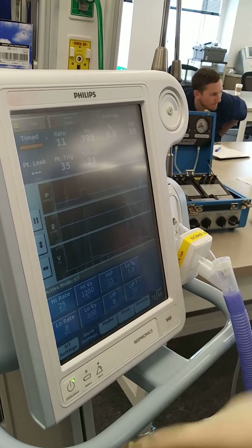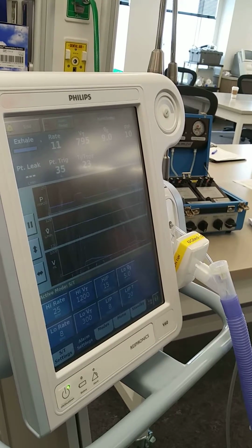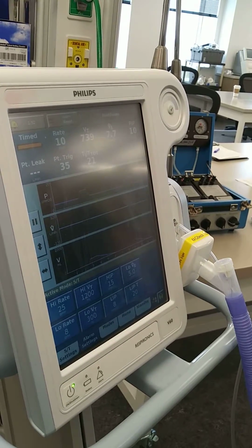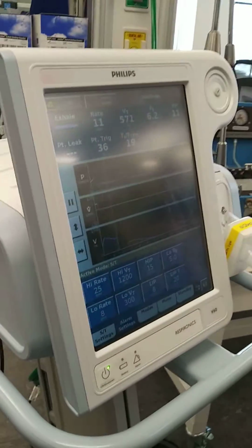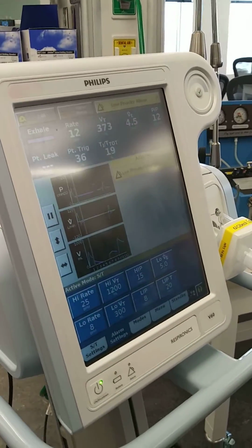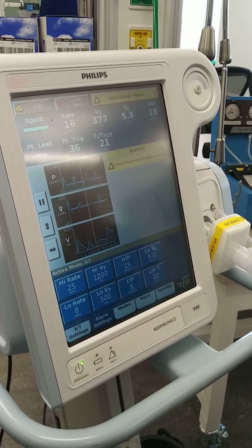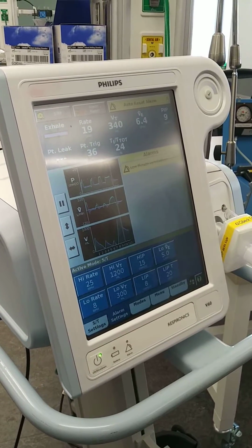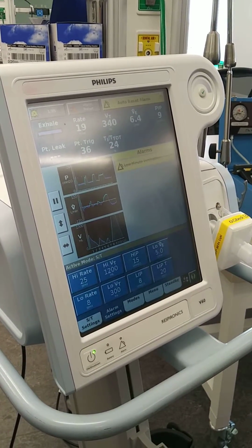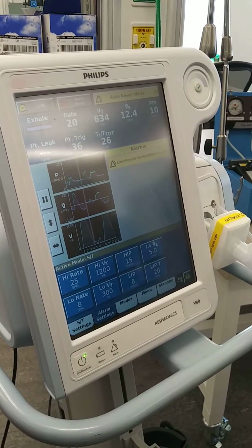I always hit alarm reset and alarm silence right after the change, just in case something immediately goes off again. And then I watch. How you doing? It is hard to talk because it's blowing at you. Every time you take any sort of breath, it's triggering. Just take a few big deep breaths. Let's see if we can get that patient trigger number up a little bit.